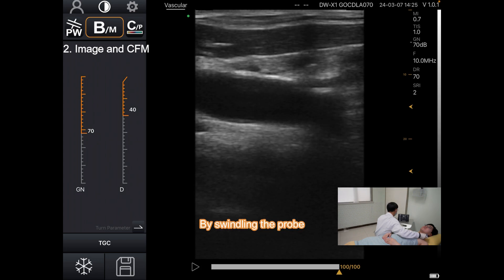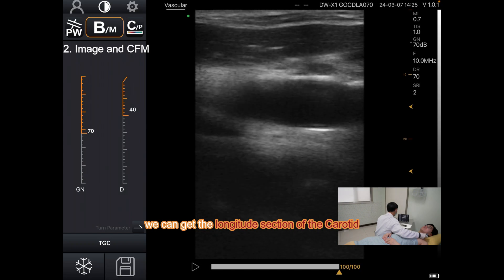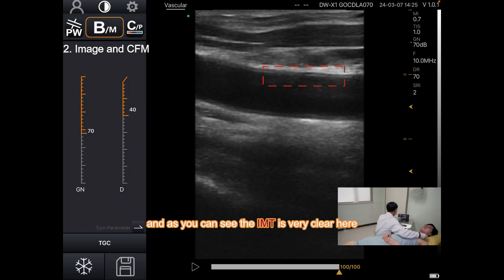By rotating the probe, we can get the longitudinal section of the carotid. And as you can see, the IMT is very clear here.